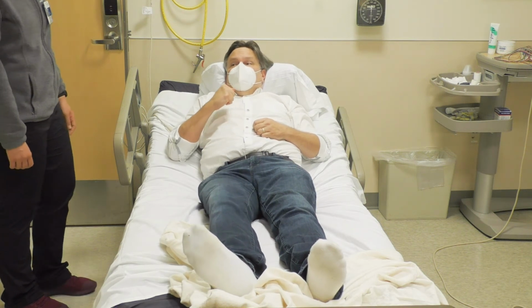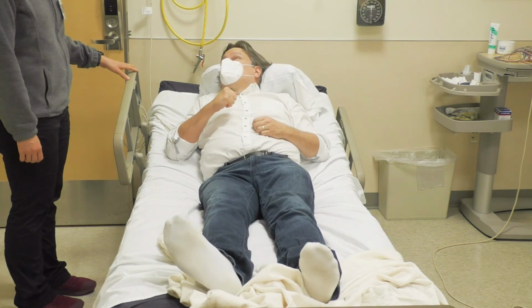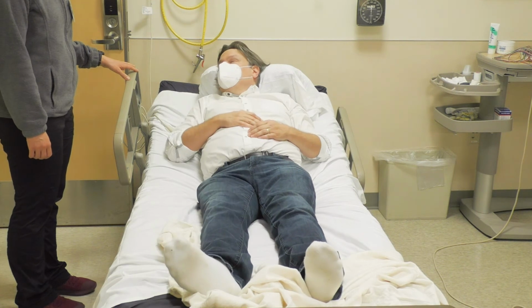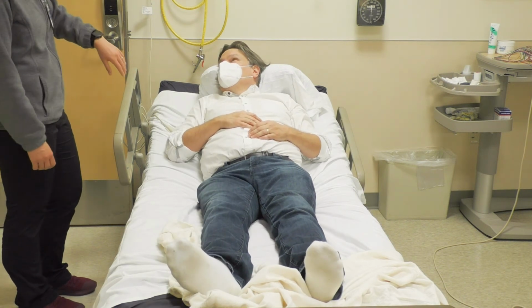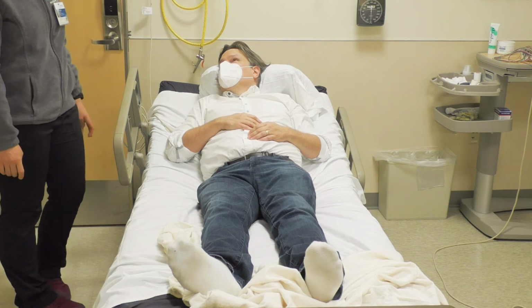Right arm shaking, right leg shaking, head turning to the right. Patient relaxes. Seizure end at 1:30, approximately 2 minutes. So again, if the seizure goes more than 2 minutes or so, or whatever the order is in the computer, give the rescue Ativan and notify the attending.